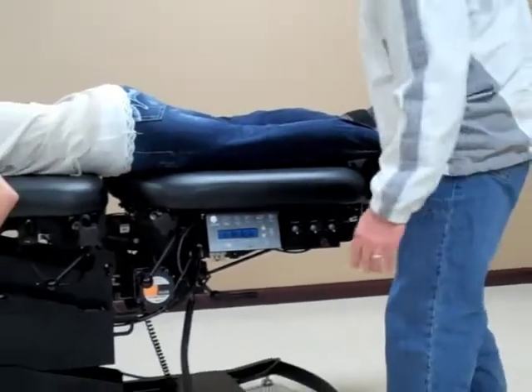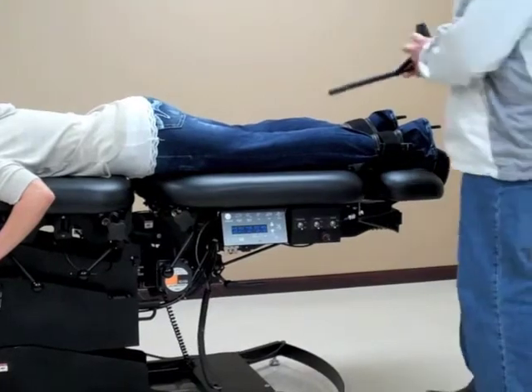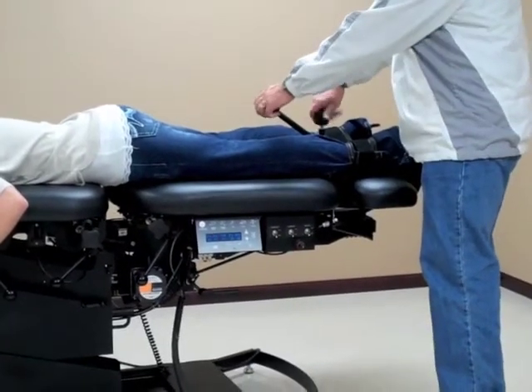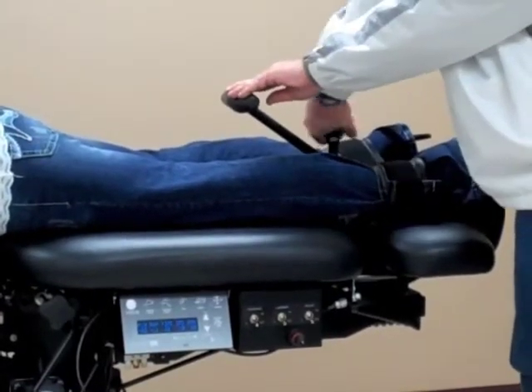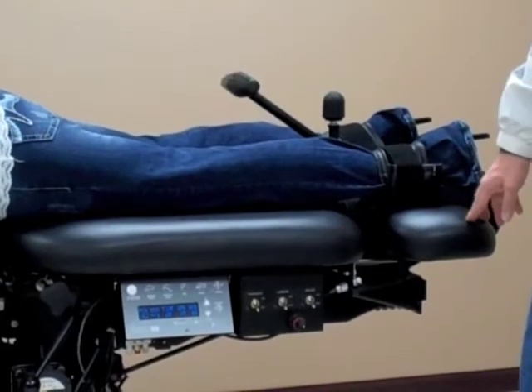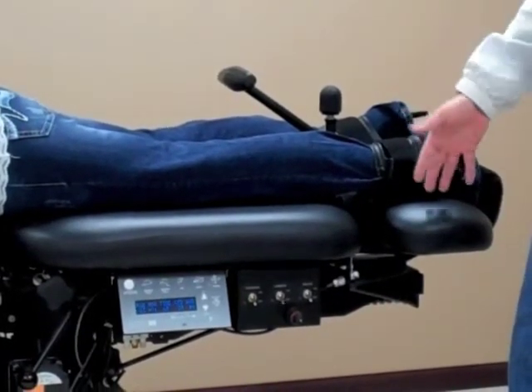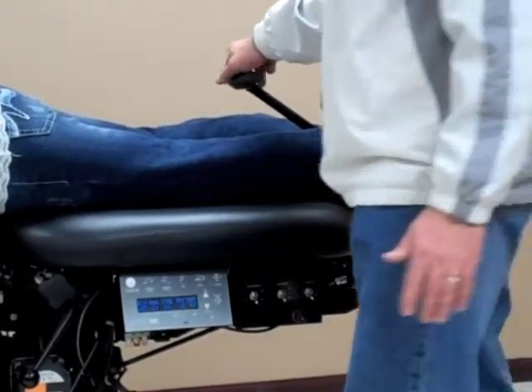The first step, if we want to do any manual flexion, we can insert the T-bar in, tighten the knob by twisting, and secure the handle for our flexion — whether it be to manually flex the table or to lateral bend the table as well.